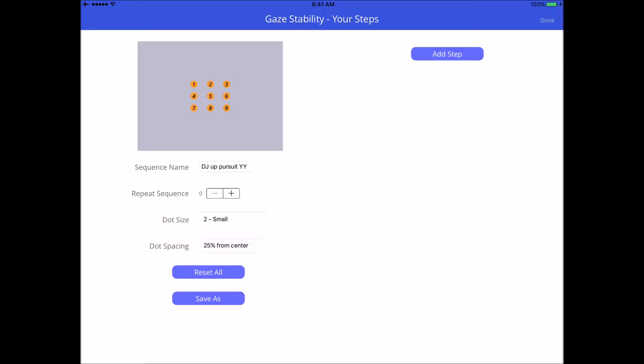First page here, when you open it up and you go into the settings, you'll see that you can name the exercise. You could put your patient name or whatever you want to do in order to remember what it is, where it is, and what it's for.